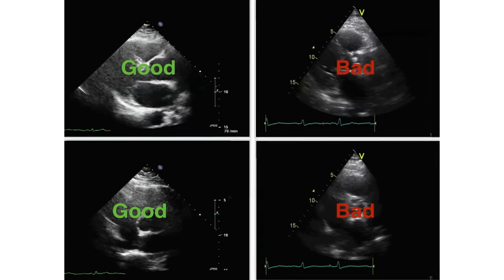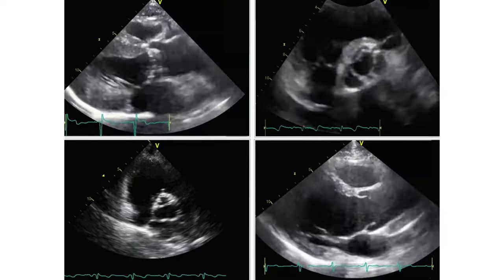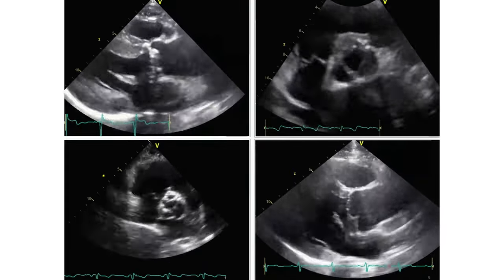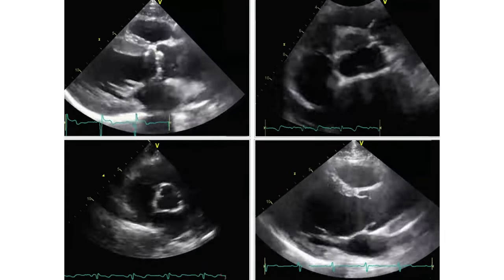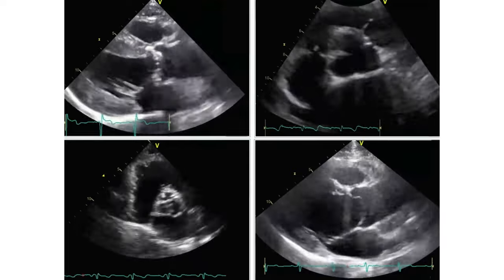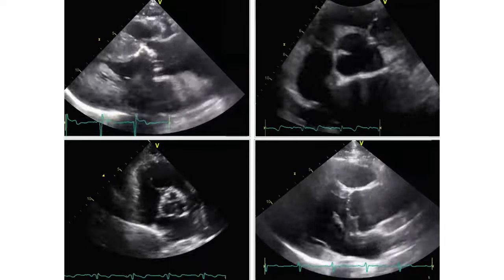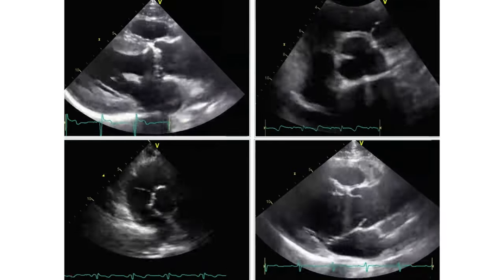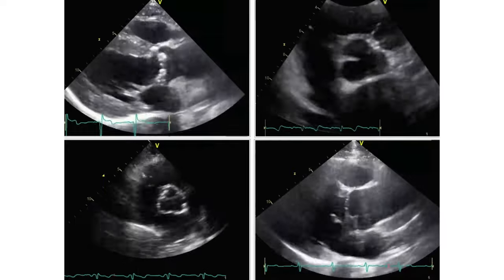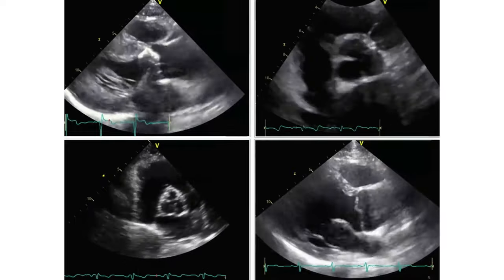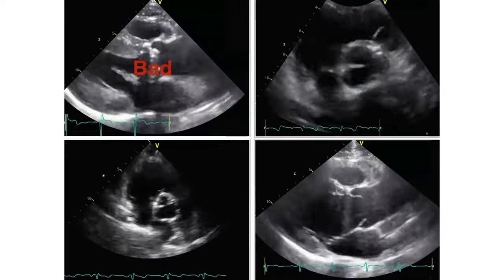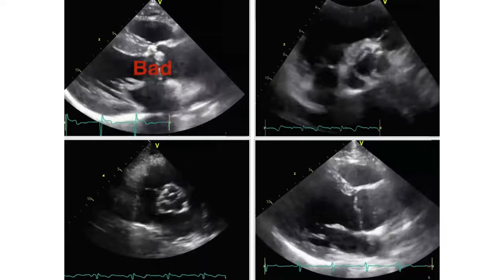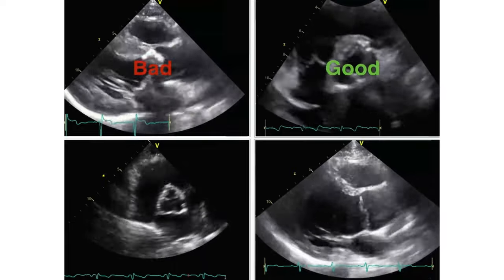And still some other examples for you. Again we have aortic valves, long and short axis. The first one: we see a lot of calcification, we cannot even distinguish the opening — this is a bad valve. Next to it, a good valve.